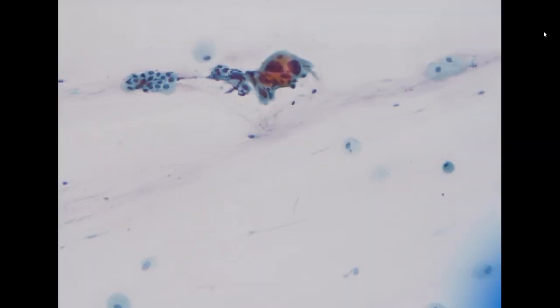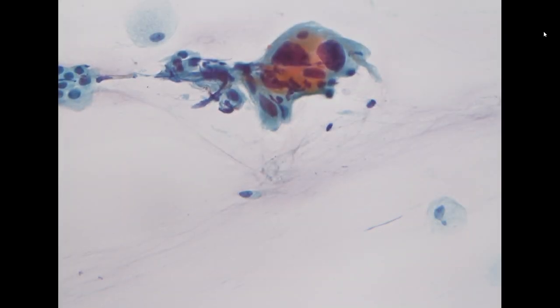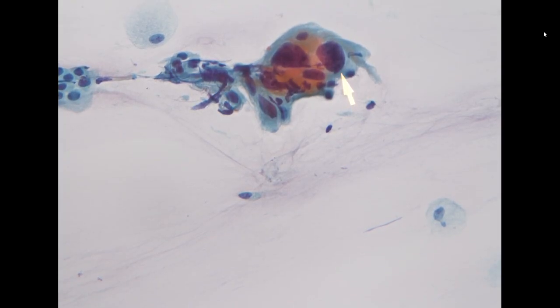In this scenario, even though she is 92, we shouldn't interpret this as an atrophy feature, okay? This is too much for atrophy. So this is not atrophy. So I think we'd better call this ASC-H. This is a good example for ASC-H. The cell is not well preserved, but it is markedly enlarged with very strange shape, right? And we cannot see coarse chromatin because it's not well preserved, but this qualifies for ASC-H.